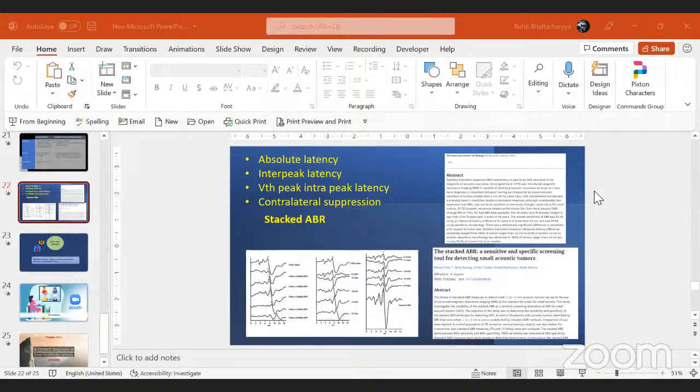Okay. So the parameters for serviceable hearing: pure tone threshold is 50 dB and SDS is 50 to 69. SDS is 50 to 69. So why is it important? It is important because if the patient still has serviceable hearing, the approach is not translab, because he still has the hearing. So you have to choose another option for the approach to the CP angle. So this is important: along with the pure tone thresholds, the speech discrimination score matters in case of retrocochlear pathology, especially for vestibular schwannoma.